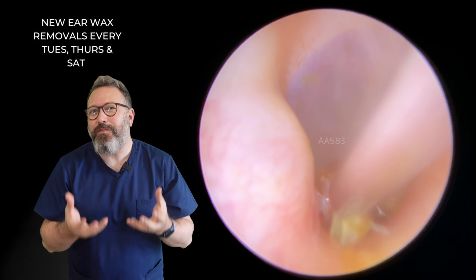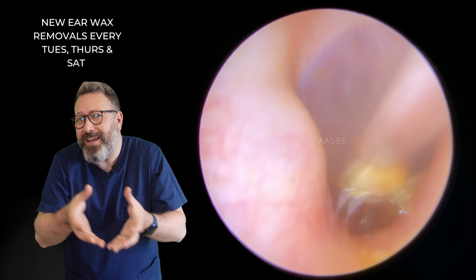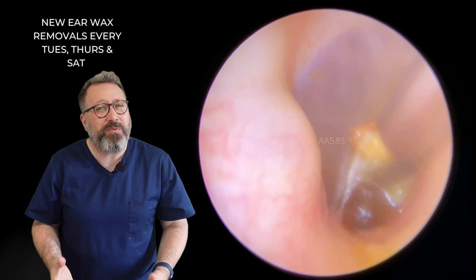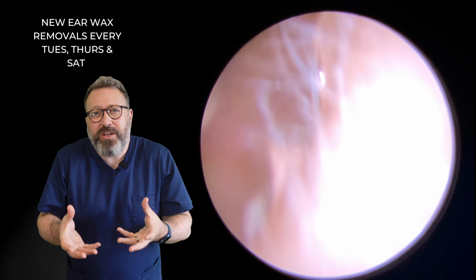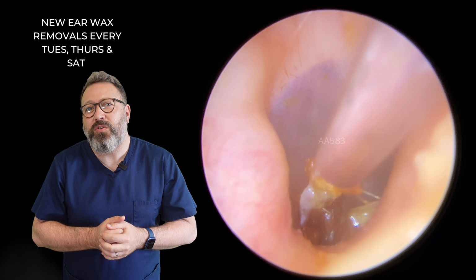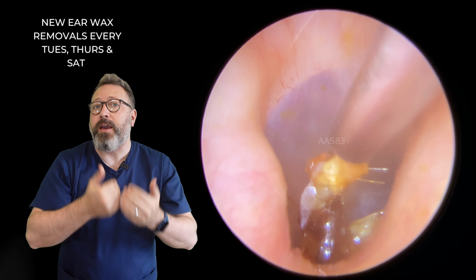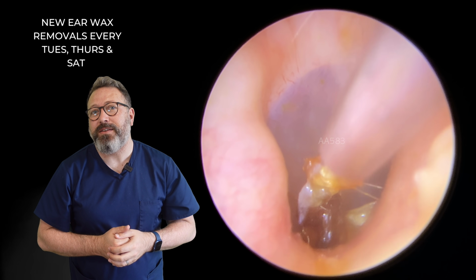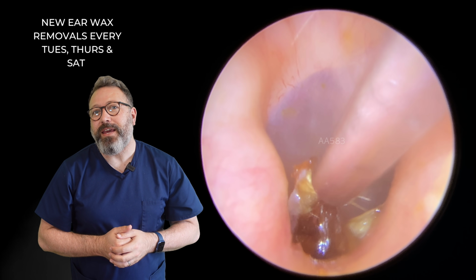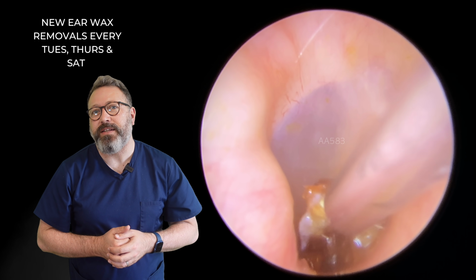So I'm trying to lift it. I don't want to push it against the drum, which would be really uncomfortable for the patient. We don't want to hit the canal walls because that would also be really uncomfortable for the patient. So we're just very gently trying to lift this whole section. Let's see if we can get a hold of that top section because it's folded forward, so more towards the camera here. But you can see as I'm lifting, it doesn't want to let go. It's really holding tight in there.